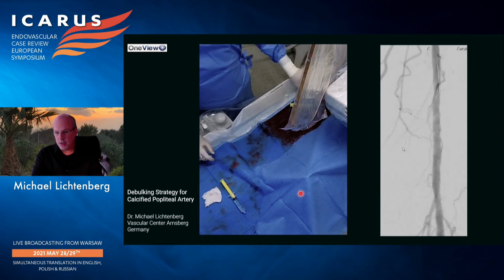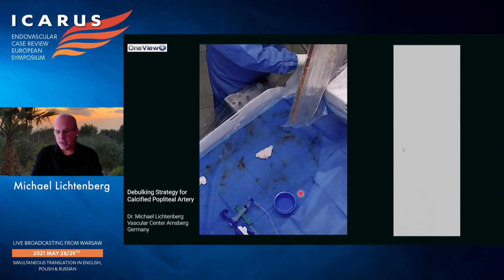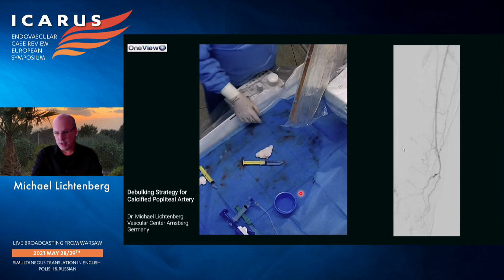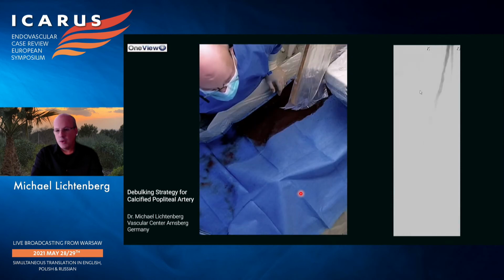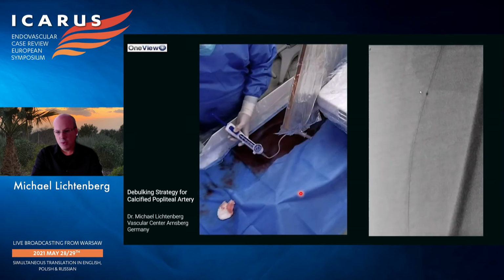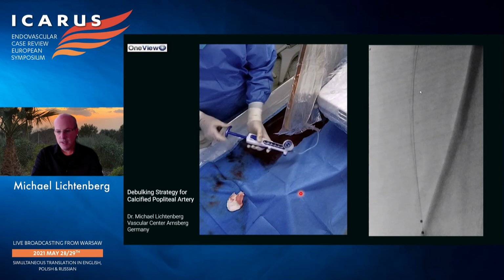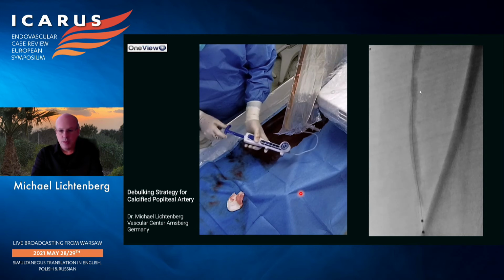Here the popliteal artery after atherectomy and DCB looked very well. But what about the rest of the SFA? Here we used a different approach, just to show you that there is a different outcome between different lesion preparation devices. In the SFA, we are now going to use a scoring technology device from BD Bard, the UltraScore device, a balloon with double wire around the balloon. Here you see the device in the distal SFA and the mid SFA. This is a 200 millimeter scoring balloon.